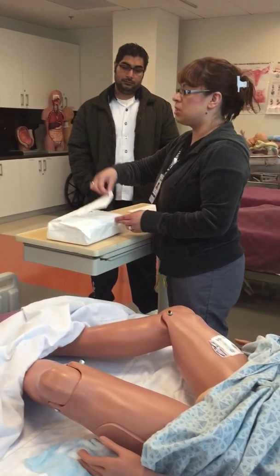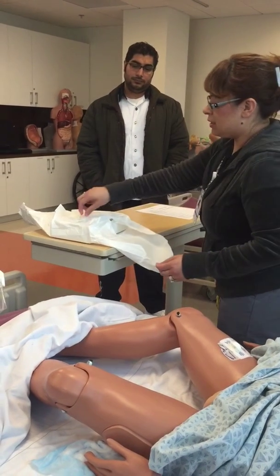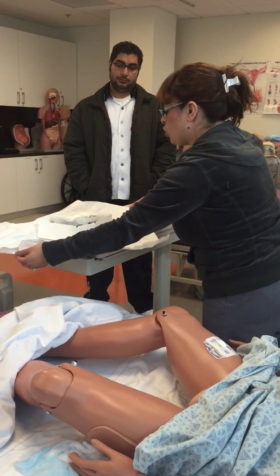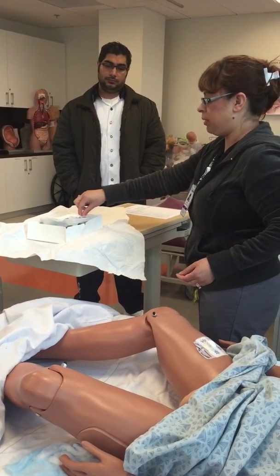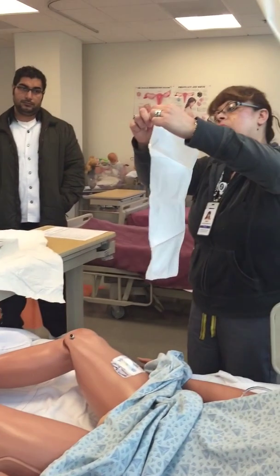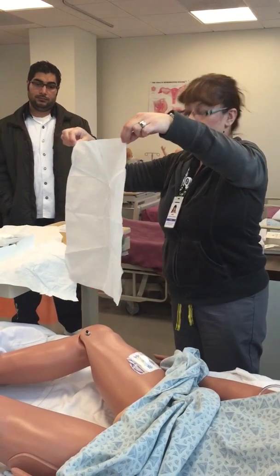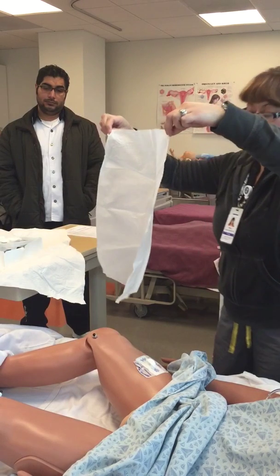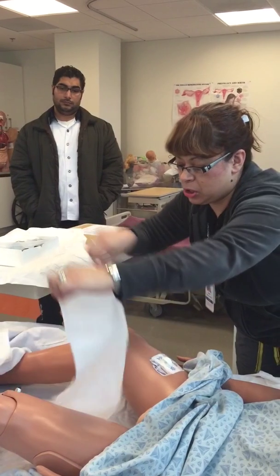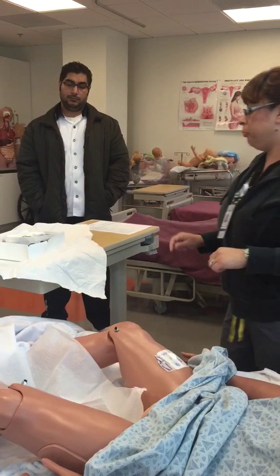So just like opening all your sterile fields, you want to first pull away from you, and then side to side. The very first thing you should encounter is the sheet that you're going to put under the patient. You pull that away from you. You do have a 1-inch border, and most of the time your patient should be able to move. If they can't, then you're just going to drop it. In her case, because it's a mannequin and she can't move, shiny side down, I'm just going to let it drop, okay?